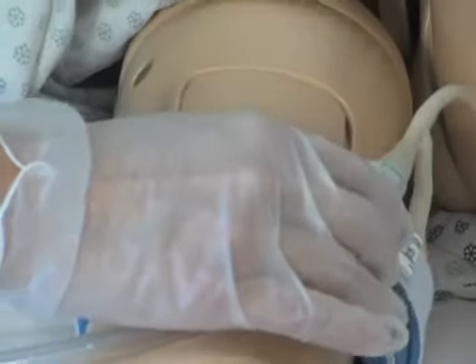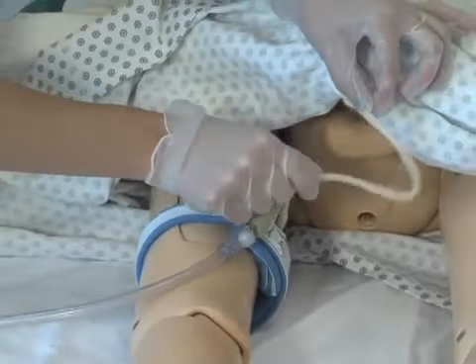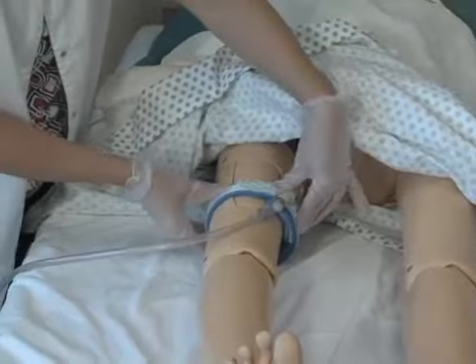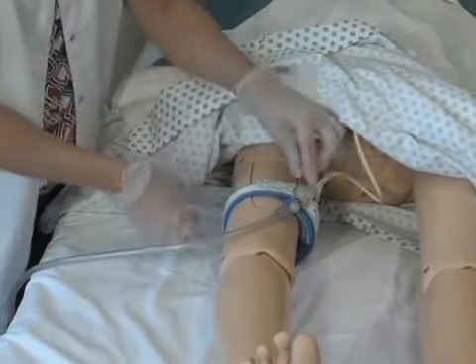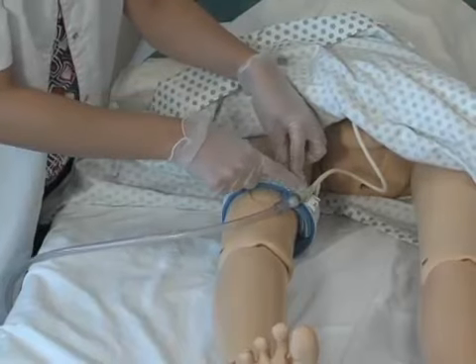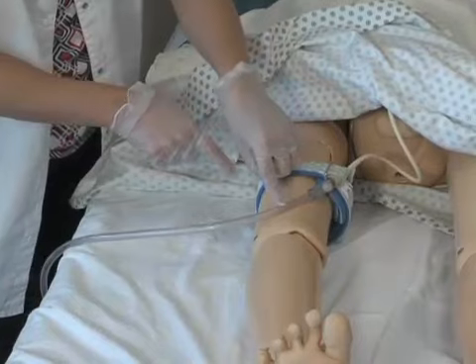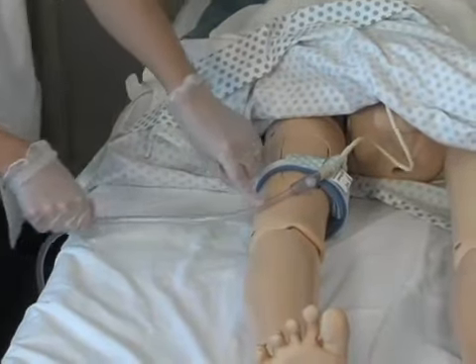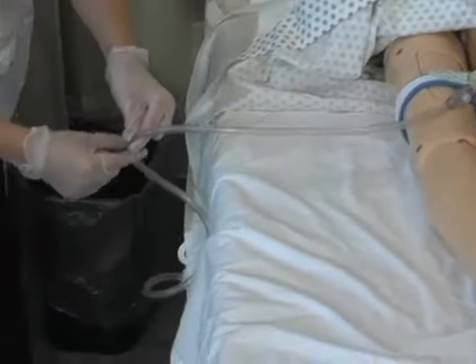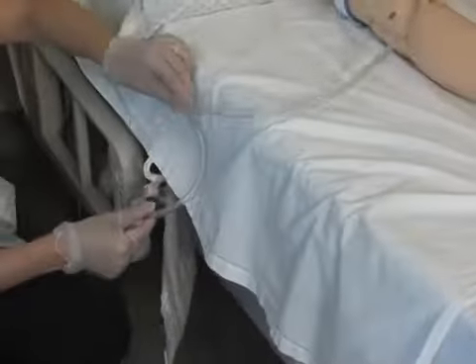Make sure it's secure. It's important that there is enough of the catheter outside so it doesn't pull if the patient moves, and that the leg has the strap on. The catheter should be attached to the inner side of the leg. Also, it should be over the thigh, and it should drain in a descending order, and it should be below the level of the bladder.